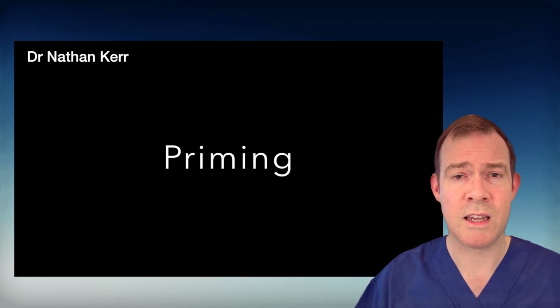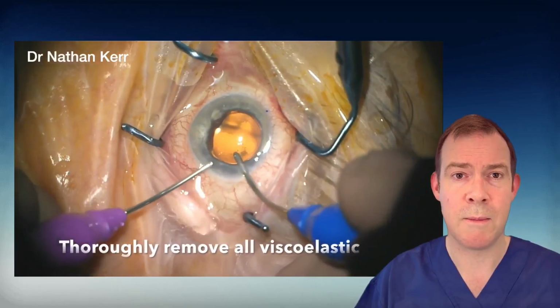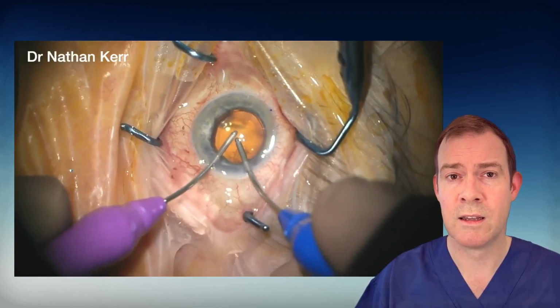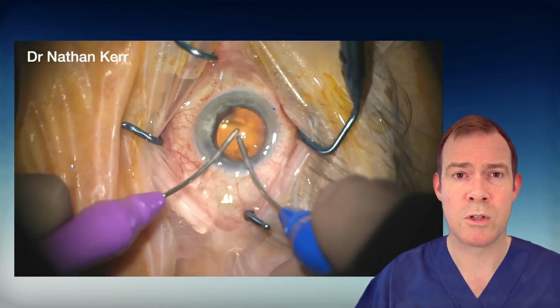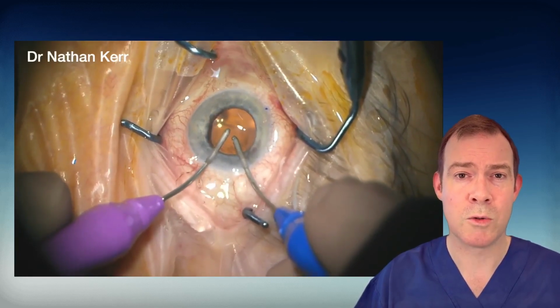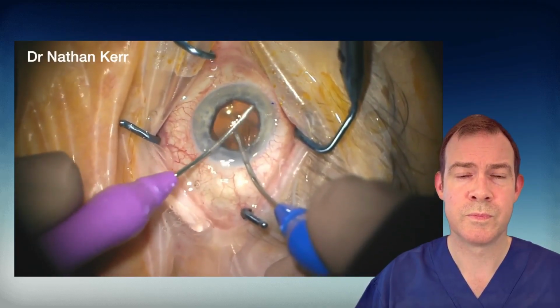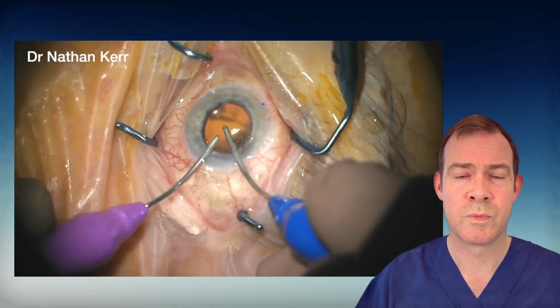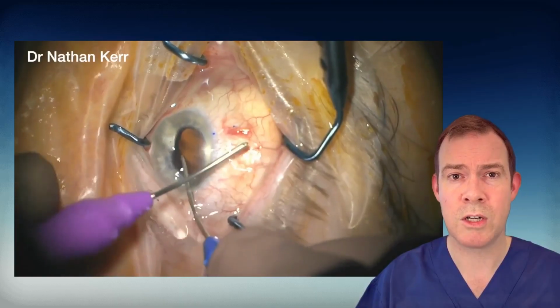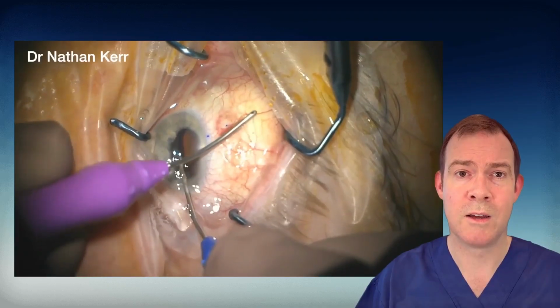We now want to prime the XEN to ensure that it's flowing and free before leaving theatre. Here I'm using bimanual IA to thoroughly remove all of the viscoelastic, being thorough but careful not to dislodge the XEN. This is important to help prevent an early postoperative IOP spike. Now leaving the irrigation port in the eye to increase intraocular pressure and to ensure that there is formation of a low and diffuse bleb on the table.